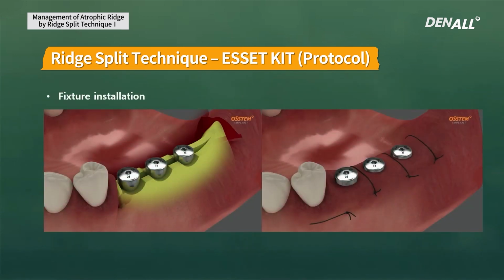If there is good primary stability, you can connect the healing abutment. In most cases, you can get favorable primary stability. You move on without doing a graft and close the flap. In most cases, you do not need a vertical releasing incision. You can do this procedure with only a crestal incision. You can minimize the operation field. It does not require additional graft. At times, if you choose the right indication, you can get a very favorable result.